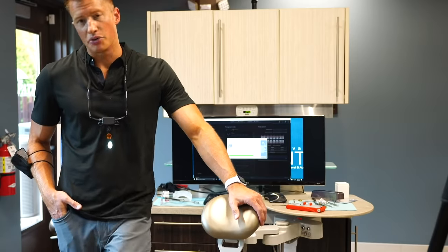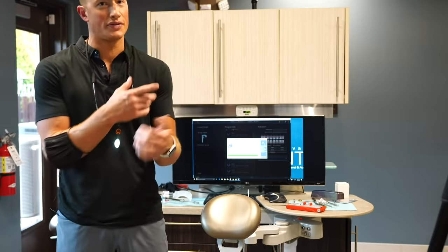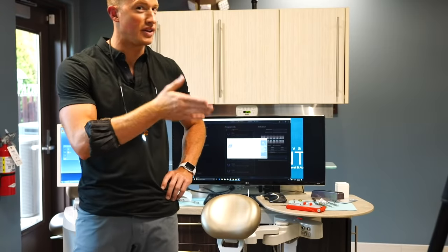There are some implant systems that aren't self-tapping. The problem with an implant that doesn't self-tap is that, remember earlier when I was asked how quickly you can do an implant in the front, once again I'll reference Eva, who is an immediate implant number 8, and I'll show that video in the next few weeks, that it would be impossible or very difficult with an implant that didn't self-tap, or a non-threaded implant, one that doesn't engage and get tighter as you go in. It's nice to have those because you can get immediate stability. If you do not have those threads, you can place an implant without those type of threads, or just fins.